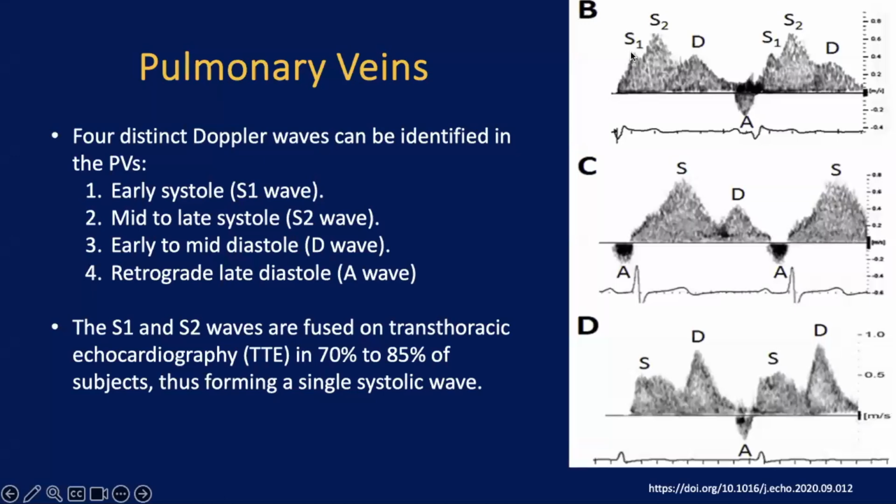How about the pulse? All of those are normal. The shape will be different from one patient to another. However, it should be taken in the right context. So how many waves do we have? We have S1, we have S2. What's the difference between S1 and S2?